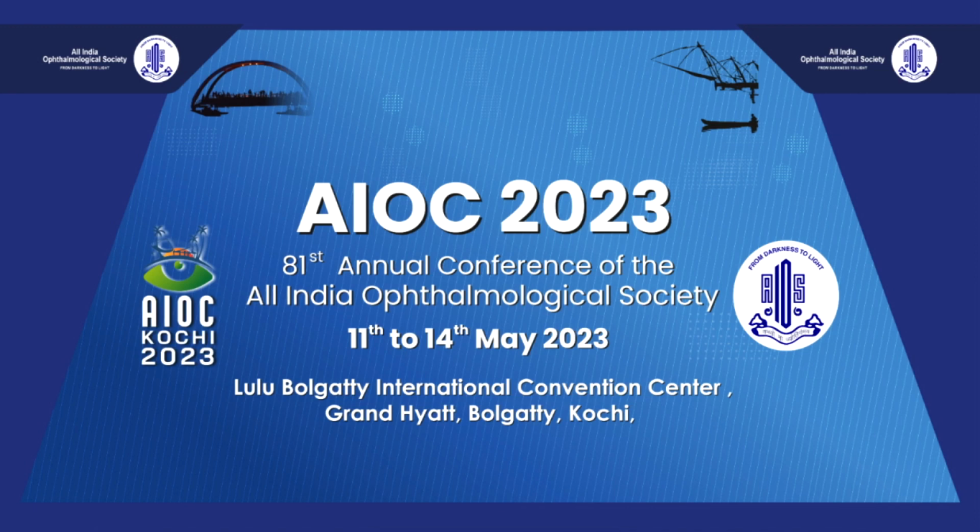So my first choice for all optical keratoplasties is femto only. As a private practitioner, I always offer the femtosecond laser option. So in cases of very dense scar or repeat graft or vascularization, I sometimes offer manual keratoplasty also. The main indication for manual is financial grounds, because many patients cannot afford it, because this charges 50,000 more than the manual keratoplasty. So my choice is femto for all the optical cases.